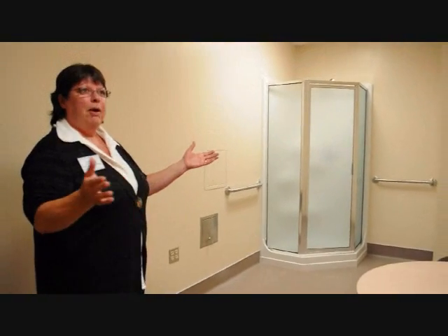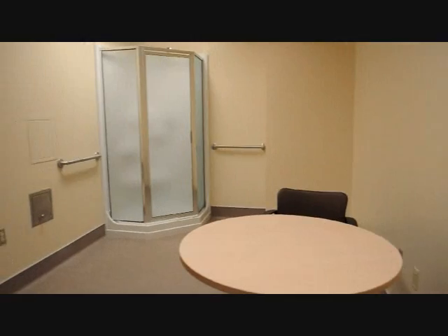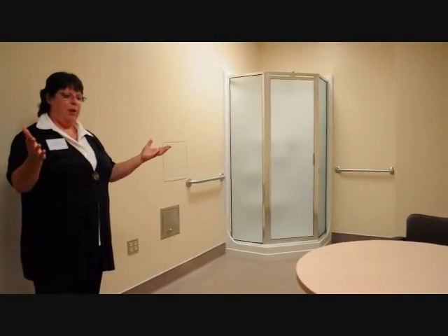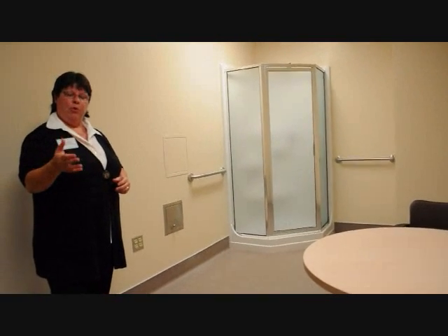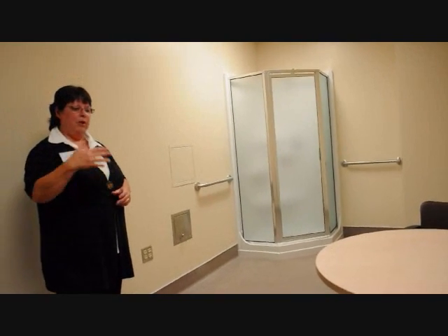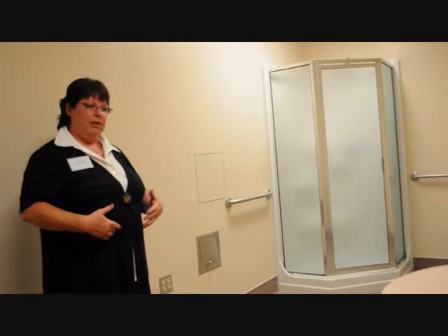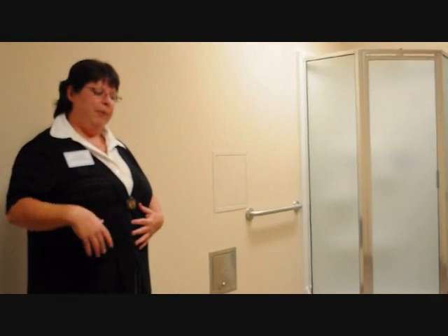And this is the peritoneal dialysis training room, and this is where we'd be training patients that choose the modality for home peritoneal. We start with the CAPD, which is continuous ambulatory peritoneal dialysis. That's our manual form of dialysis. We use a twin bag system. We have a catheter that is inserted into the abdominal area. We use our peritoneal membrane as our filter.